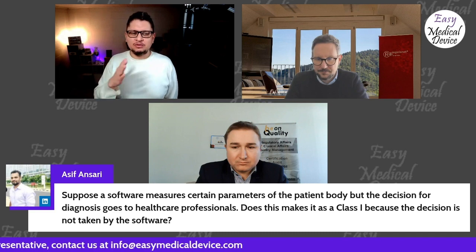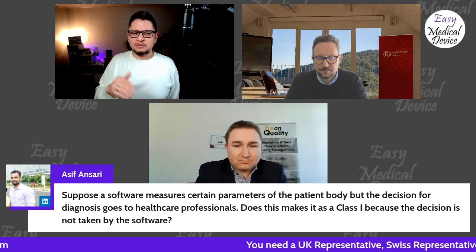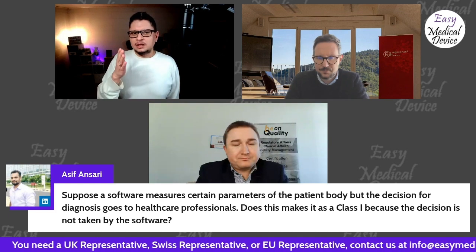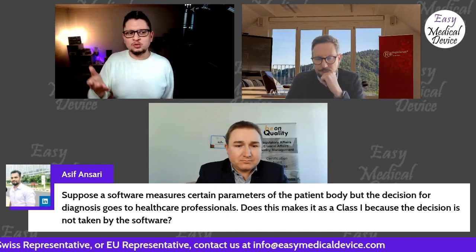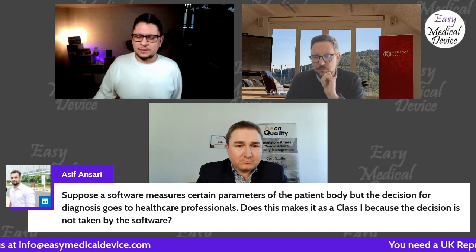Exactly. I think this is important: as soon as there is some diagnostic or therapeutic decision to take, and a software gathers information that will be used by the physician to take this decision, then it goes under this rule, so class 2A here.